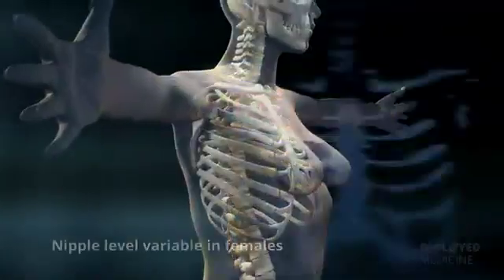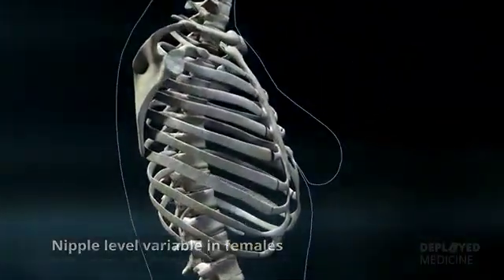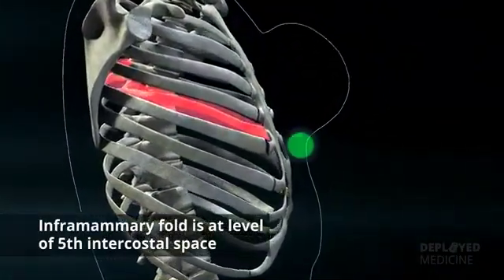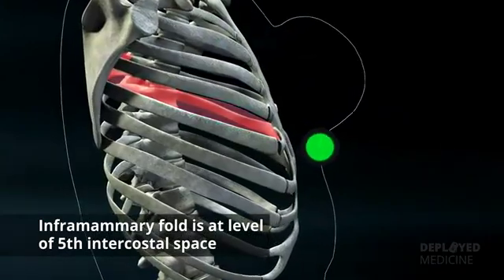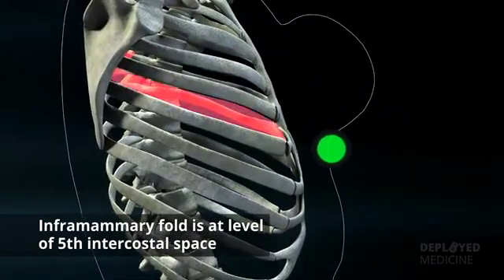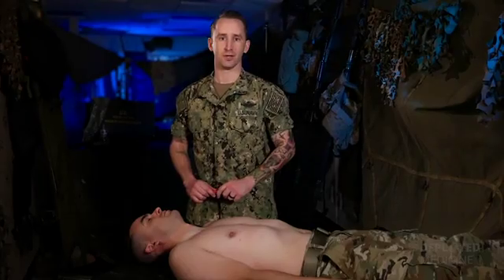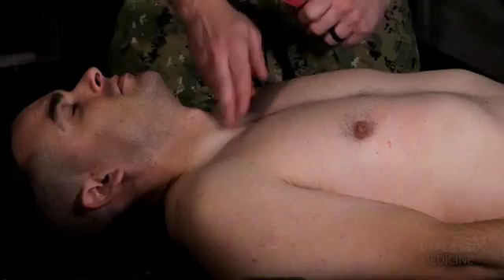The nipple level is variable in females, but you can lift the breast and use the level of the inframammary fold. I'm going to demonstrate on the second intercostal space mid-clavicular line.